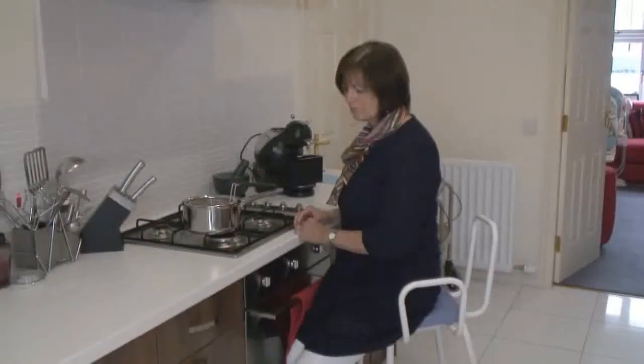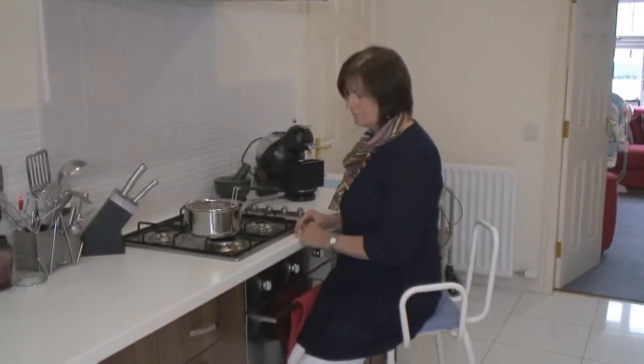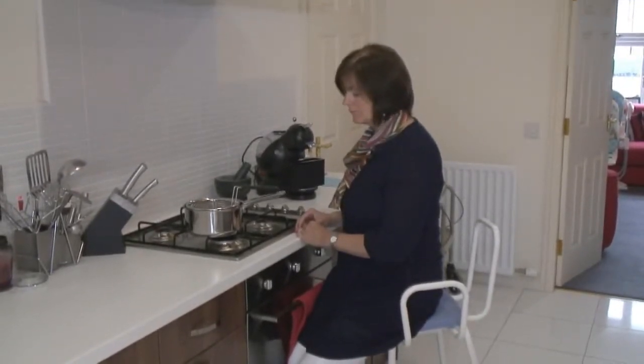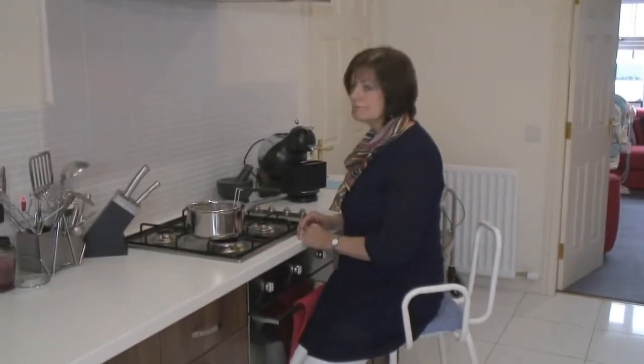So it allows you to access your cooker. It can be used at the sink. It can be used for ironing, for sitting to prepare vegetables. Outwith the kitchen, it can also be used in the bathroom for gentlemen for wet shaving, even just to sit at your wash hand basin to brush your teeth. So a perching stool has a lot of uses, and these are all height adjustable so that it's set for the exact right height for you.